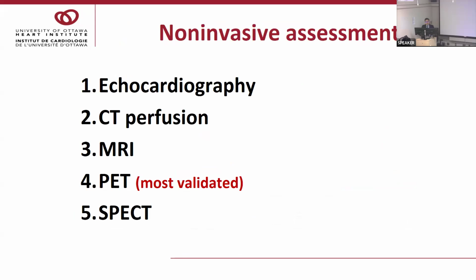Okay, now we will move on to the non-invasive assessment. Currently, there are 5 options: echo, CT, MRI, PET, and SPECT. The main focus today will be on PET and SPECT, but I will briefly touch on other modalities as well.